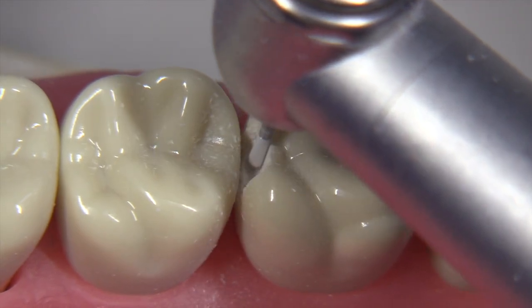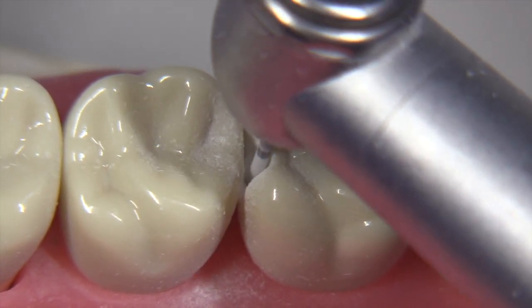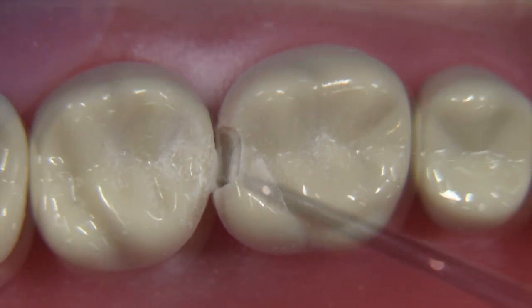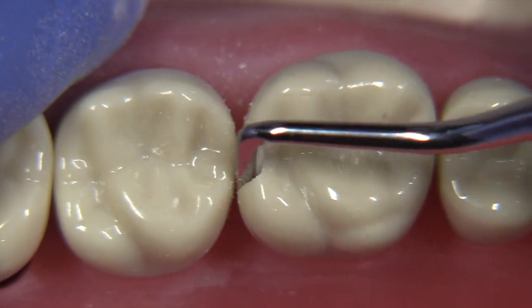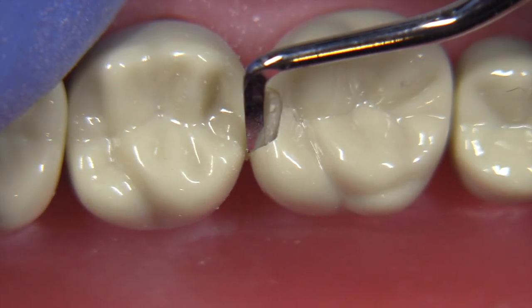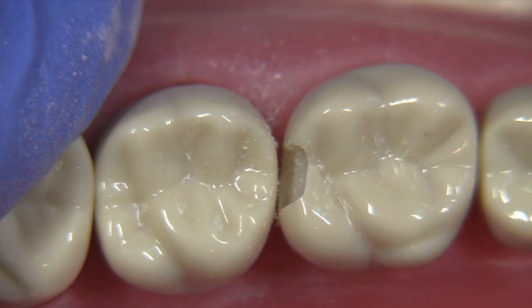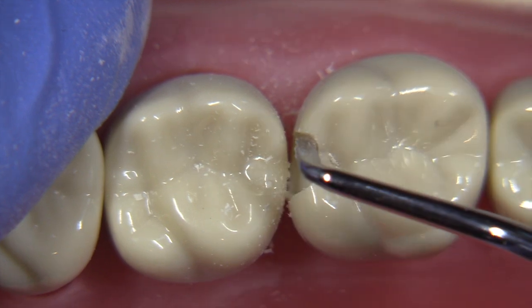Extending the gingival: the best way I've found is to make a little trough inside where your bur is not going to be next to the adjacent tooth, then you're going to create a little bird beak or ski jump type margin on the most distal aspect of that gingival wall. Then you can chop that off quite easily - you purposely create an undermined situation with the bur and then chip it away, much the same way we would make an extension on the lingual or facial. If you follow these recommendations, hitting the adjacent tooth will be a thing of the past.